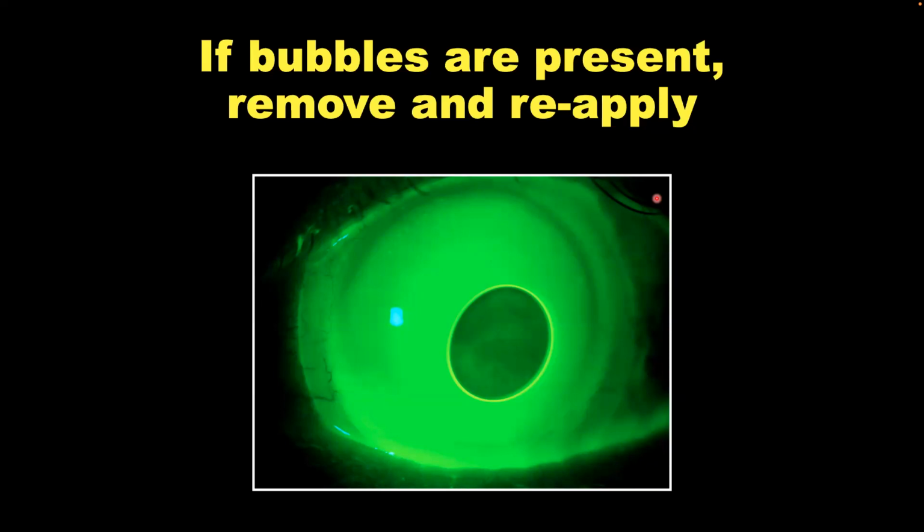I like to do this at first because I'm trying to make them aware. If they ever feel that, just remove the lens, fill it up again and insert the lens again. That's a good way to let them feel the discomfort and know what to expect.